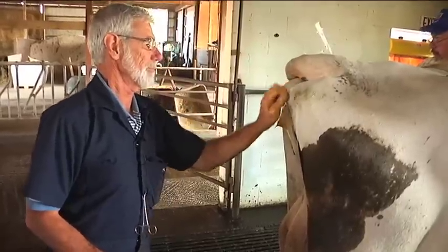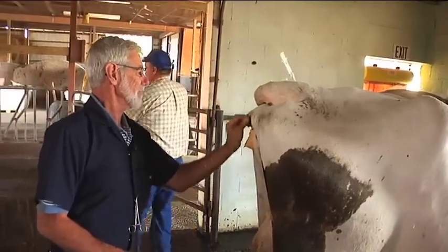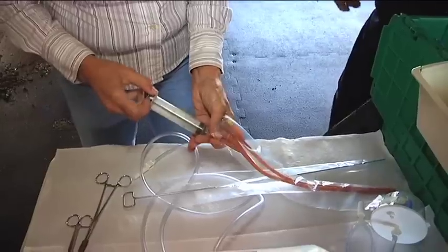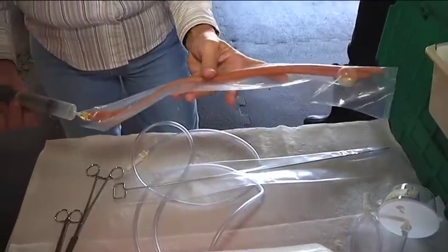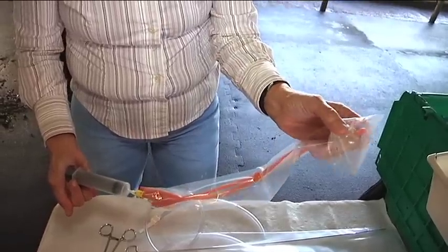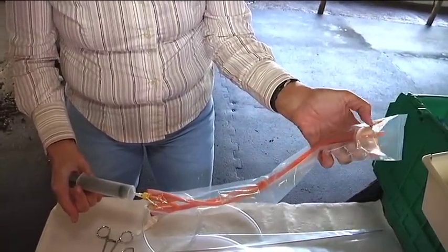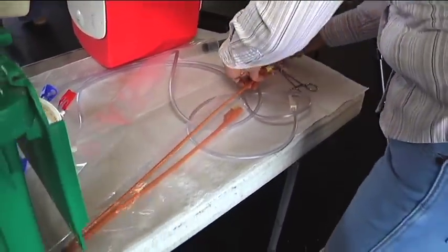The vulvar area is then scrubbed with an iodine soap solution. While the cow is being washed, the catheter is prepared. This is the Foley catheter that is put into the uterus and inflated with air via a cuff that holds it in place. Once positioned, the medium will flow in and drain back out again. Pictured here is a fully prepared catheter ready for insertion.